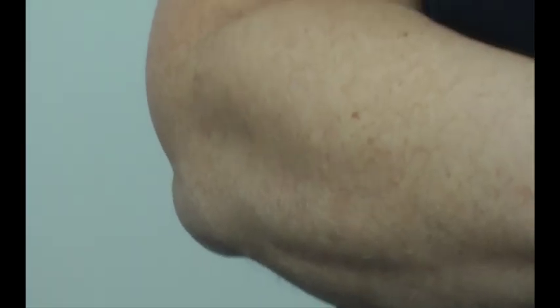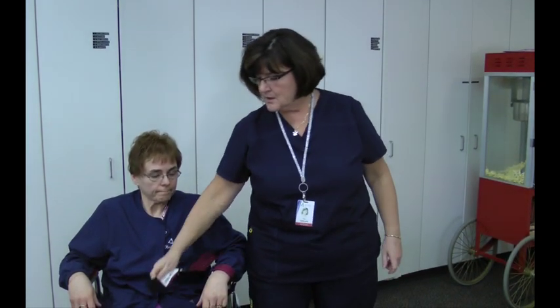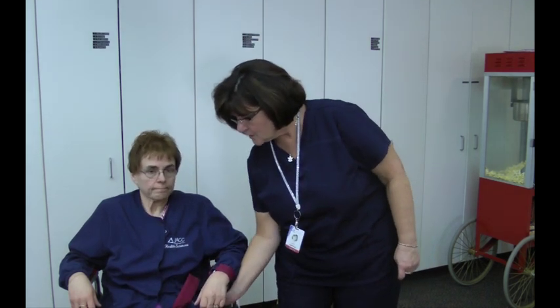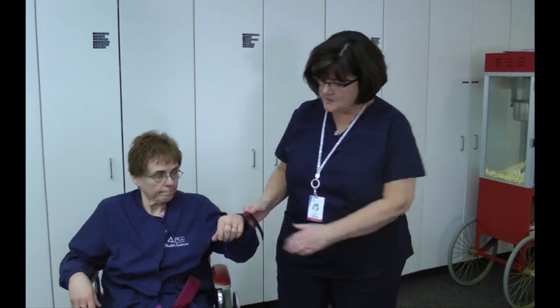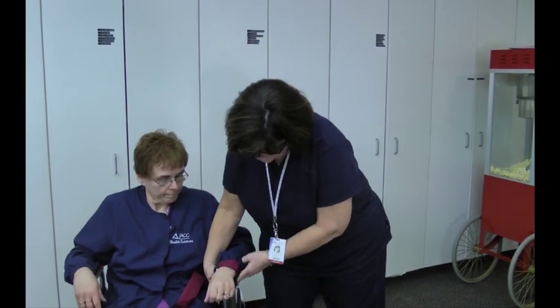Now, one of the reasons it has Velcro on it, every restraint has to be released with one pull. It cannot have a knot in it. It can't have apparatus where it's locked or a fastener of any kind. It has to be able to be released with one pull. Why do you think that's important? Well, if there was a fire or we needed to get Melissa out fast, we could do that with one pull. So Melissa, I'm just going to pretend, put that one on.